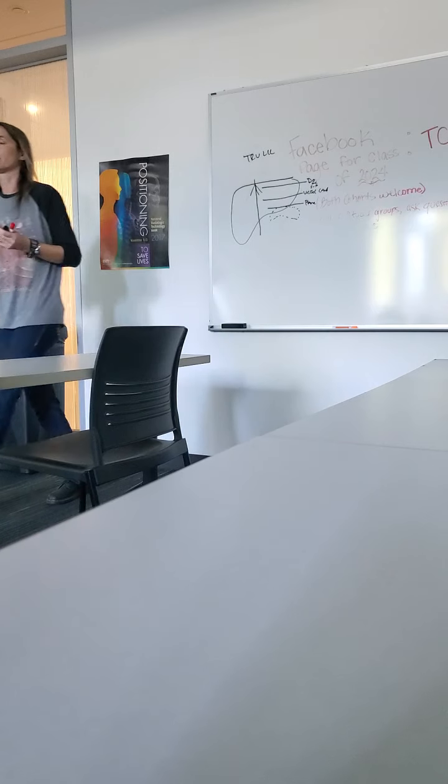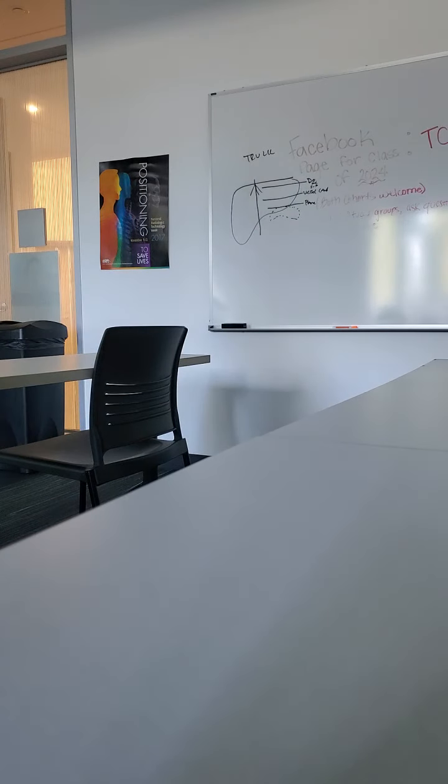So to backtrack, sagittal: IVC, medial, mid, lateral. This is gonna be dome, superior; vessel land, mid; panc land, inferior. Feeling cool so far? And there's actually a poster of this that the students made last year down in the lab that you can peek at.